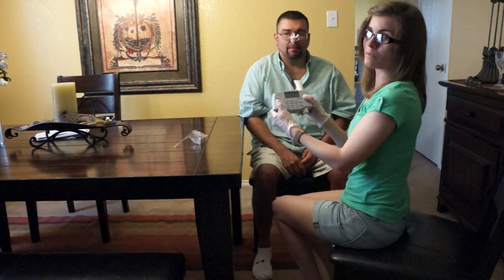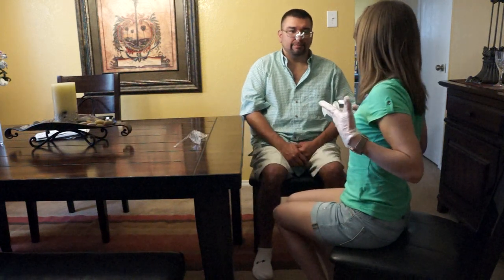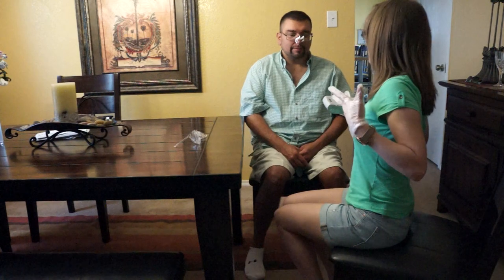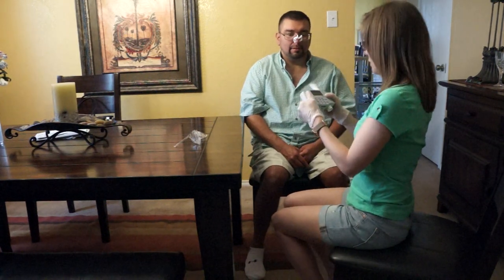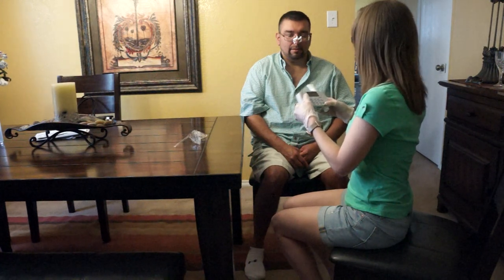Okay, it says good effort. Sometimes it may say take a deeper breath. That means he didn't fill up all the way. So when you fill up, you want to feel it all the way up into your shoulders, okay? Good deep breath, as big as you can. Fill all the way up, and then blast out hard and fast, okay? It says good effort, so good job. You did a great job. Ready for the next one?